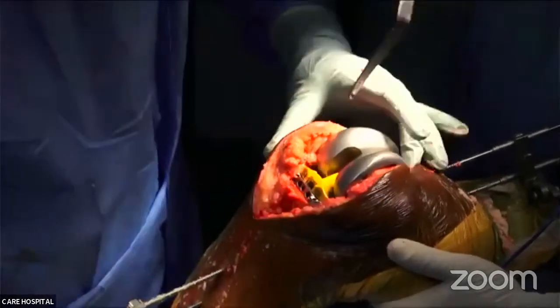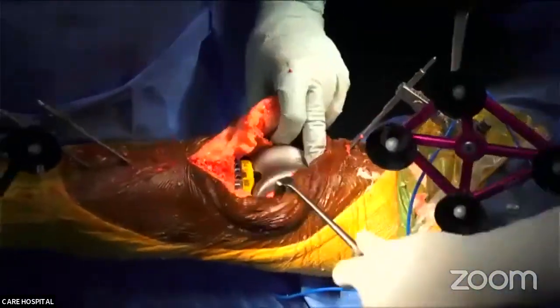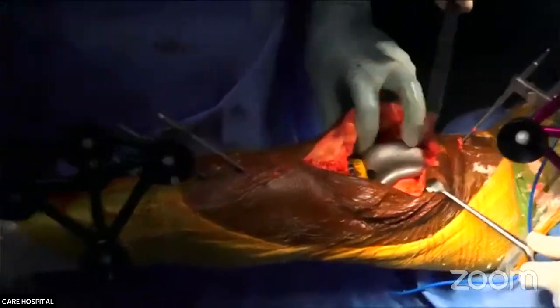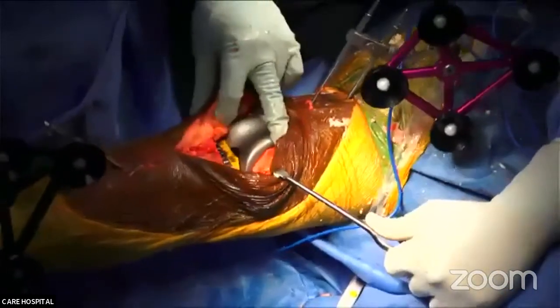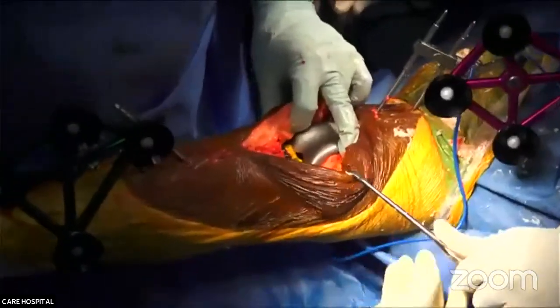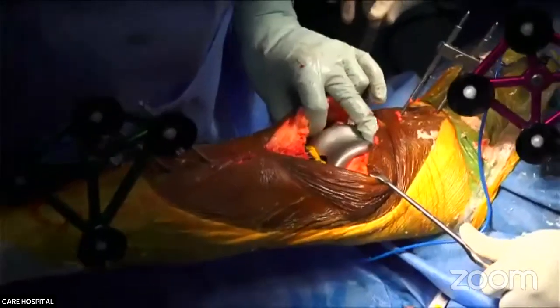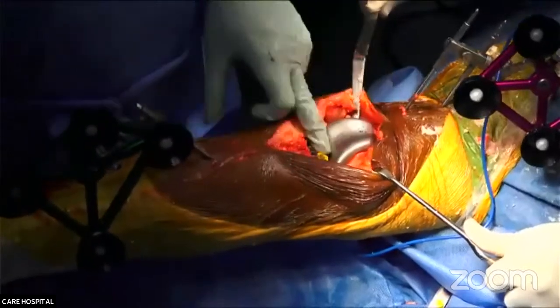Okay. So you can see there, focus on the joint. That's the mediolateral balance. Can you see that?